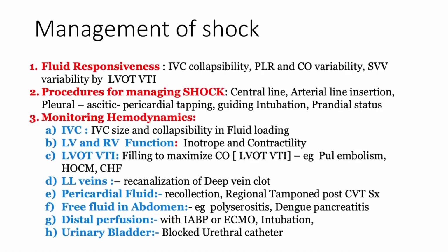You give fluid boluses, you see the lungs which were initially dry getting wet. So you stop fluid boluses and give vasopressor instead. So 30 ml per kg does not fit everybody, mind you. It is not a rule of thumb that you give 30 ml per kg for every single person. And if you are looking at sepsis, you look for reasons why this patient is in septic shock.